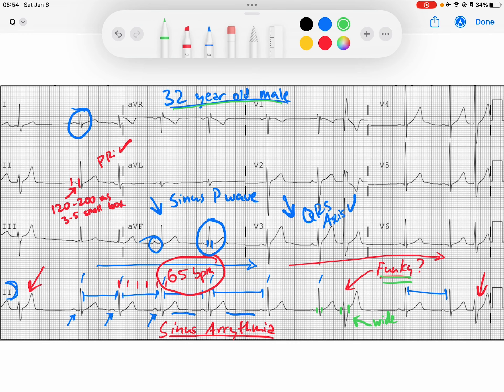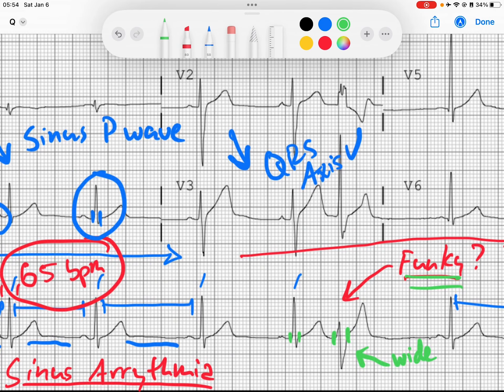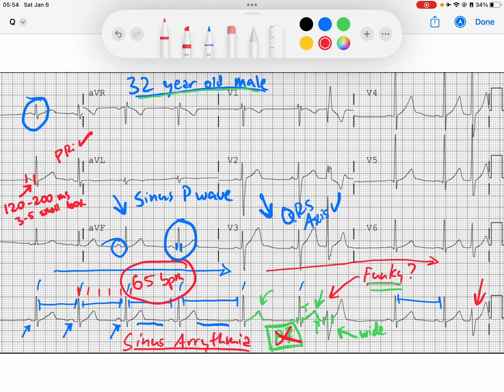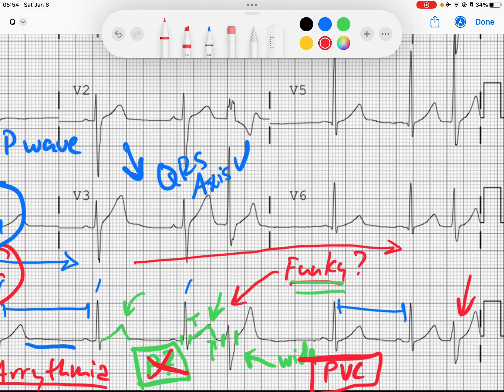The only way I can confirm it's a ventricular contraction is to look in front of that beat and ask: is there a P wave? In this case, I see a T wave from the previous beat. I do not see a P wave superimposed. I can compare it to our previous T waves to determine if a P wave might be hiding in that T wave — and I do not see one. So this wide complex premature contraction is a premature ventricular contraction. I see the same thing here — a premature, wider complex beat with no P waves in front of it. So here is another PVC.